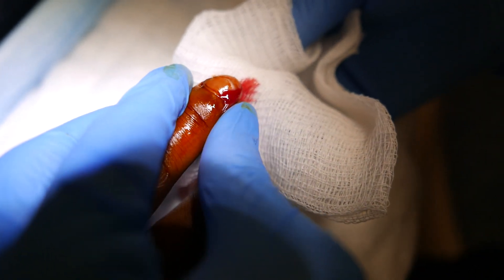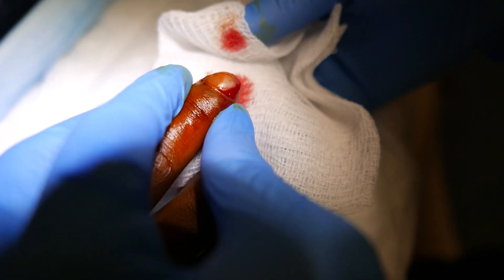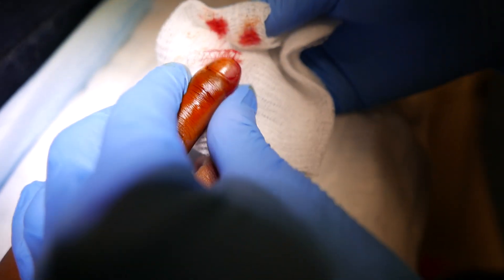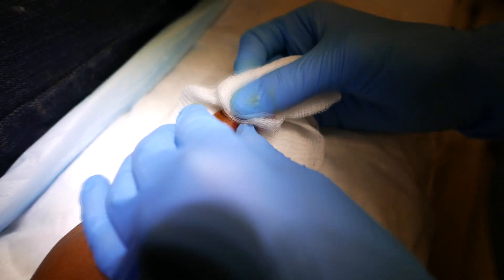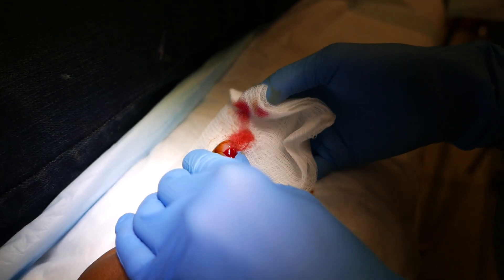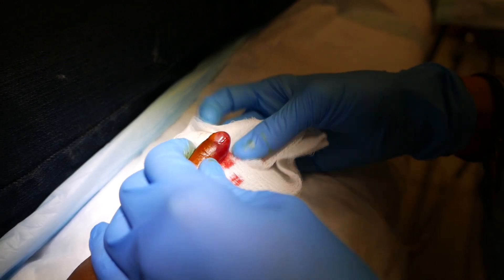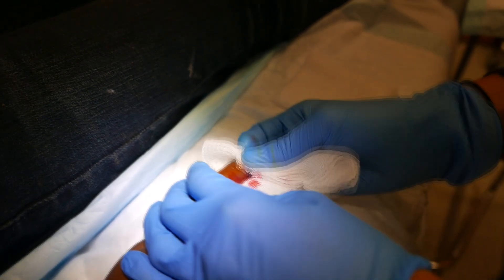We'll see. You can look when we're done — we're just about done. There was pus that came out in the beginning, yeah, you got some good pus out there. It doesn't look like it now, but it did — you just kinda milked along the side there. We'll put you on some antibiotics too, just because it's a paronychia, which is really just an abscess at the nail bed, but then it spread around and kinda started to create a felon — F-E-L-O-N — which is an infection of the finger pad. She'll go home on antibiotics. I think we got most of the pus out there.